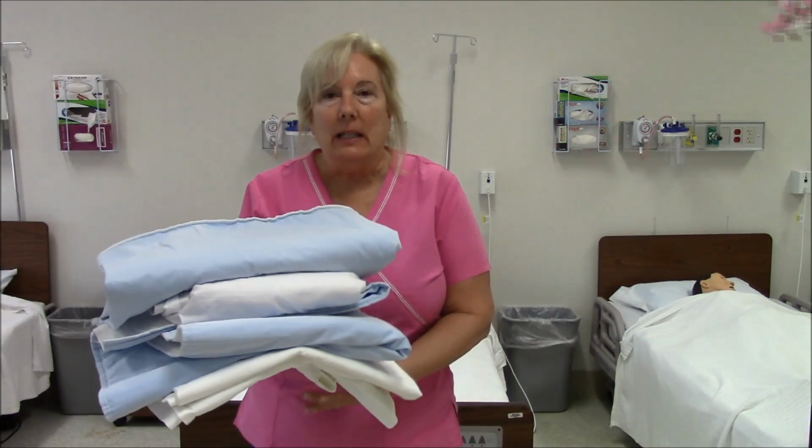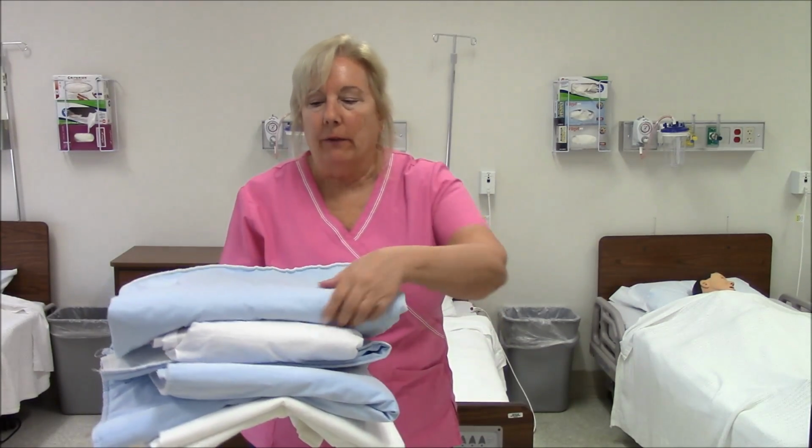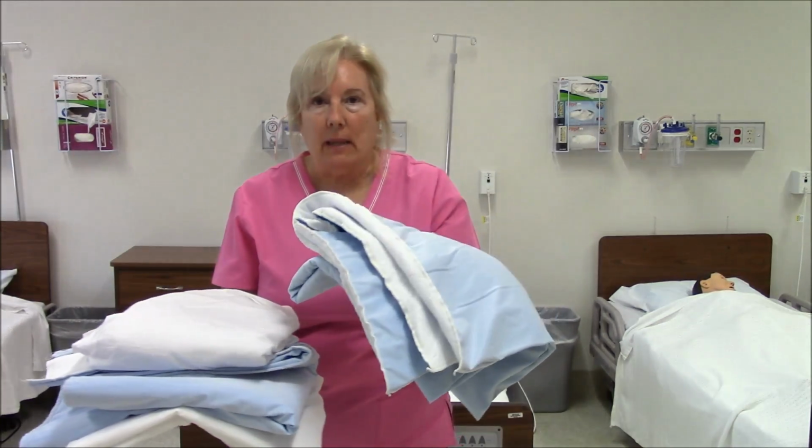Before I start the skill, as you would in any skill, you would wash your hands. I will now wash my hands for 20 seconds and I will be back with my linen. I have my linen, and my linen is in order as I'm going to put it on the bed. My first item is the bed pad.